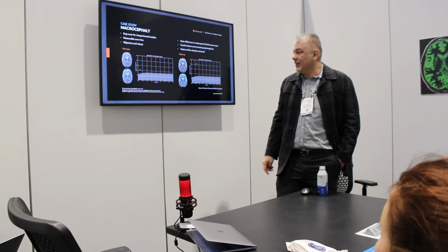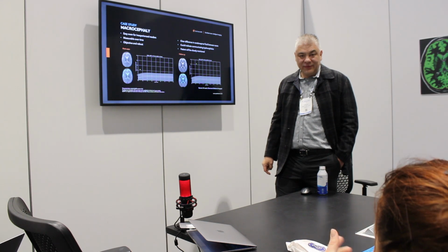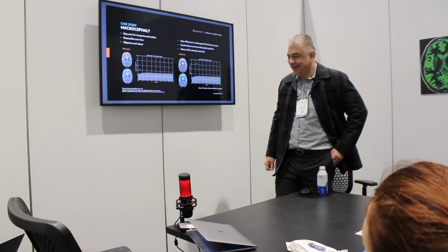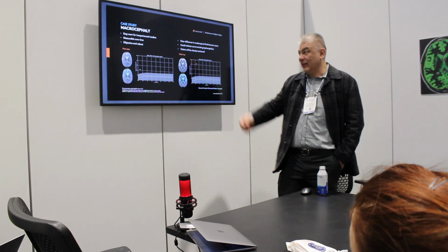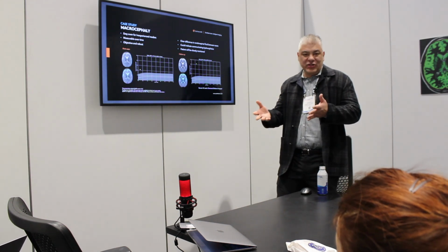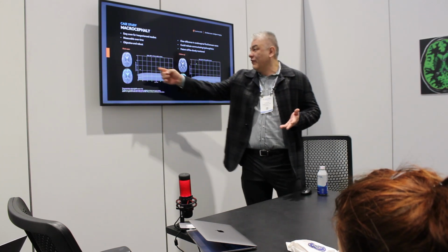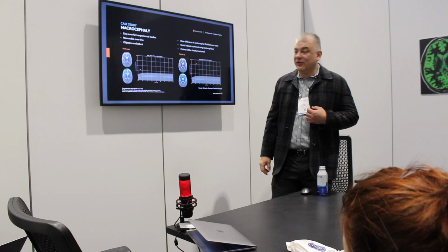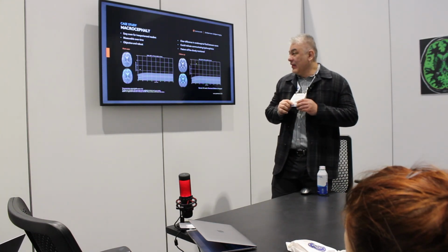But the clinical, yeah, the head is getting bigger. Okay, but then why? Why? Because that's why we scan them. Basically, our report has to match. And a lot of times, I don't know if I would have said that there is much difference in the CSF volume just looking at the standard images. Oh, I see.